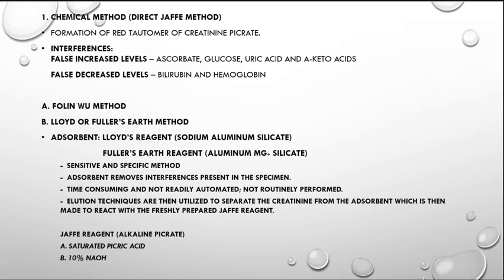Okay, so this one is time consuming and not readily automated. Therefore, it is not routinely performed. As I said earlier, the principle of your chemical method, right? We have your Jaffe reagent, which is alkaline picrate. Its composition is saturated picric acid and 10% NaOH, or sodium hydroxide.